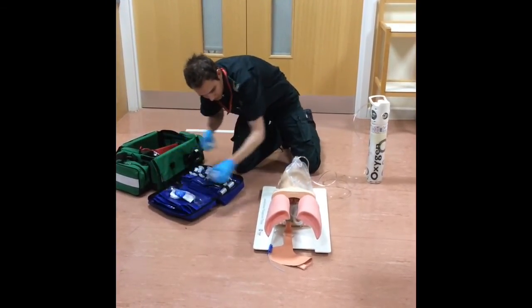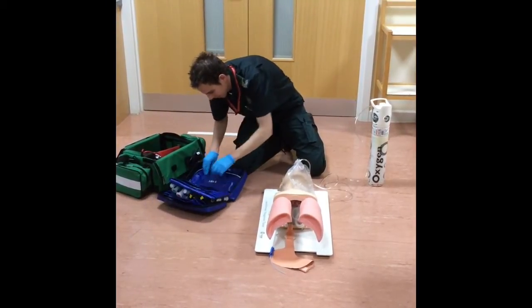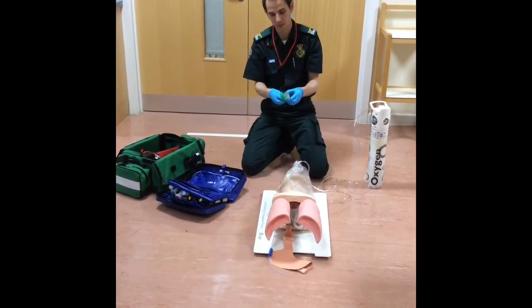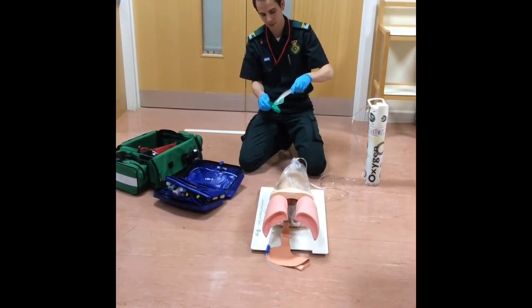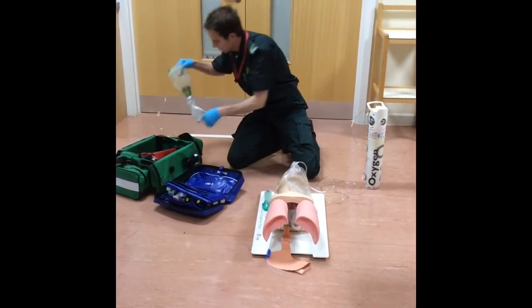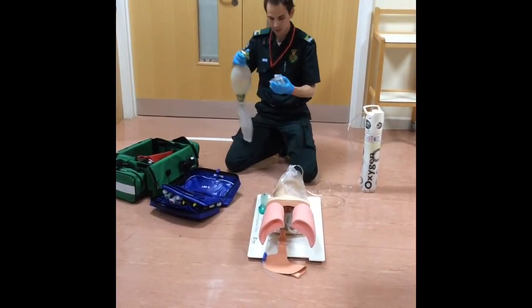And just get some of the bits and pieces ready. Okay, we'll say the patient's about 70 kilos, so I'm going to take a size 4 i-gel, which is between 50 and 90 kilos. Do my fit for purpose checks, take it out of the pack, lube the sides and the tip. Just get that ready there. Get out the bag valve mask, because I'm going to have to ventilate the patient when I've got my i-gel in.